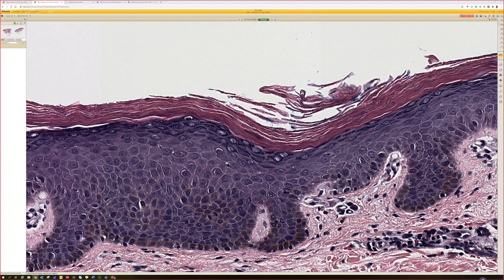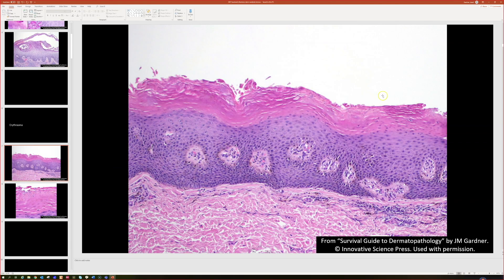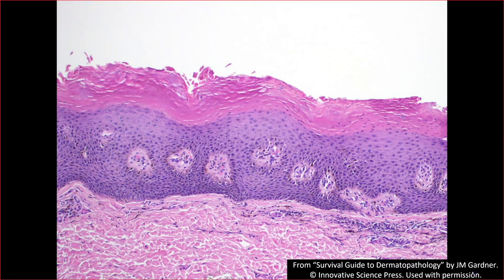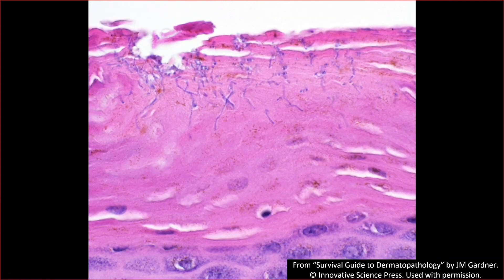Here's an example of erythrasma. Again, the compact ortho — sometimes there's a bit of spongiosis, sometimes a bit of pigment dropout and a little inflammation, but oftentimes, just like that case with the virtual slide, totally devoid of inflammation.